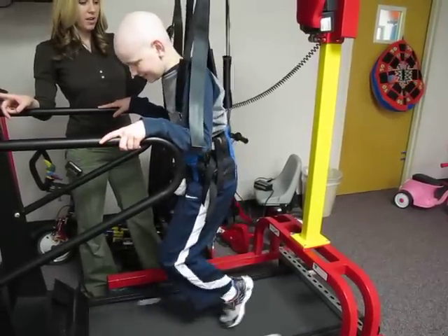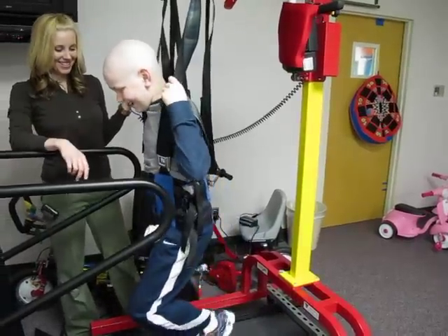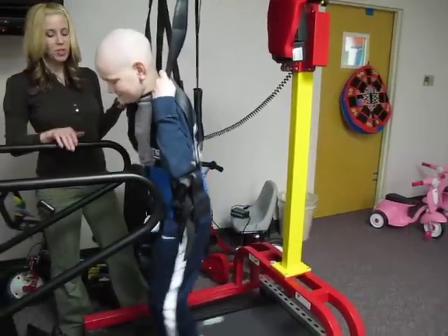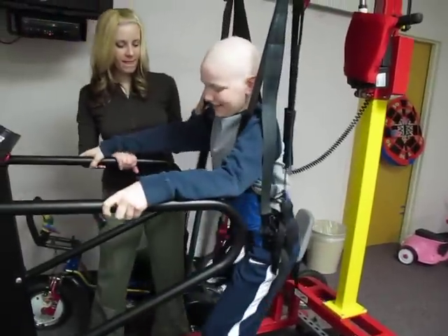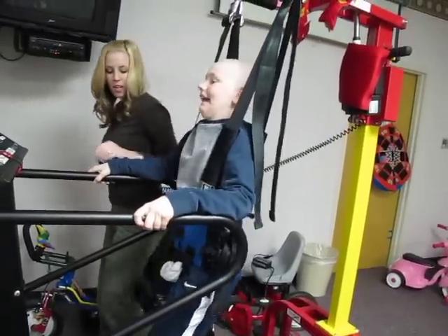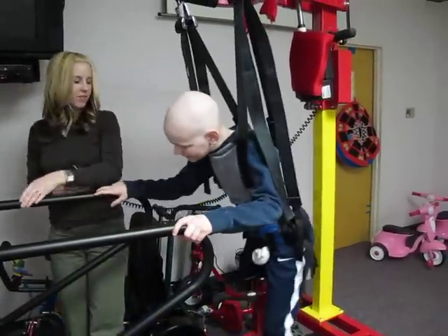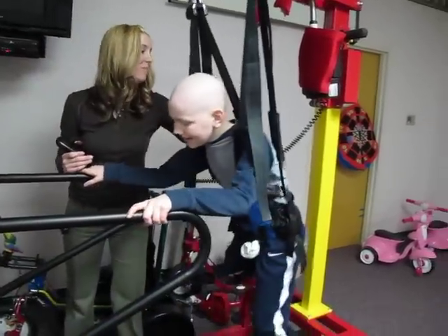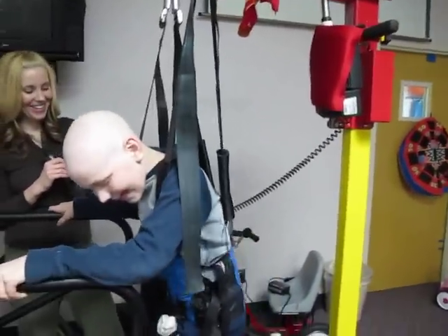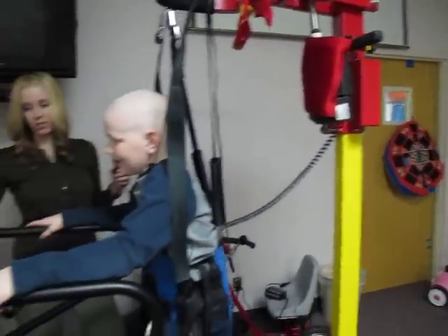Now I want you to try and stand up tall. There you go — tuck your bottom under. Too fast? Now don't put your hands on here. There you go. Focus on letting your heel land and then push off with your toe. There you go. Now don't swing too much — you're going to go this far back here. You don't want to give me a bruise. This is a Tarzan. Want to go slower? Does that feel funny?